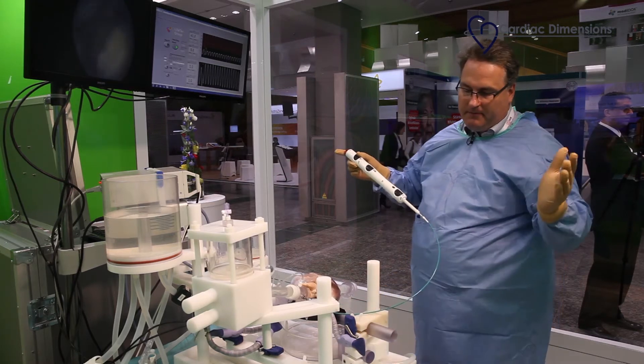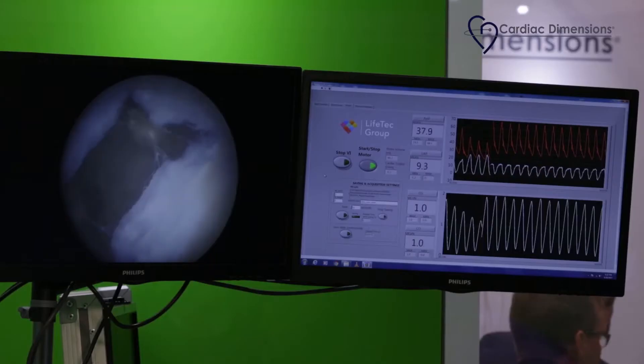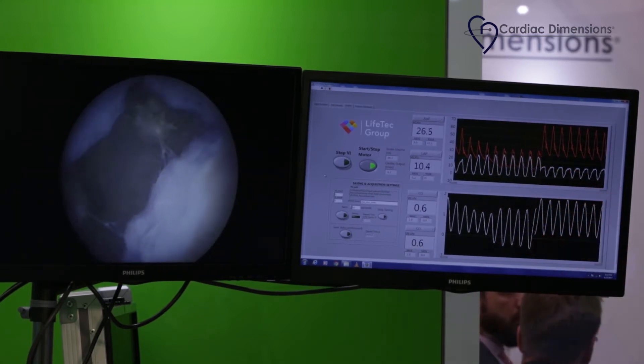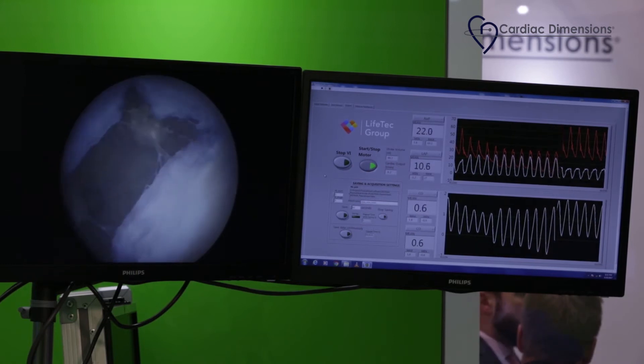I just give way to the system. The valve is now open and we see the increase in the white line of the left atrial pressure.